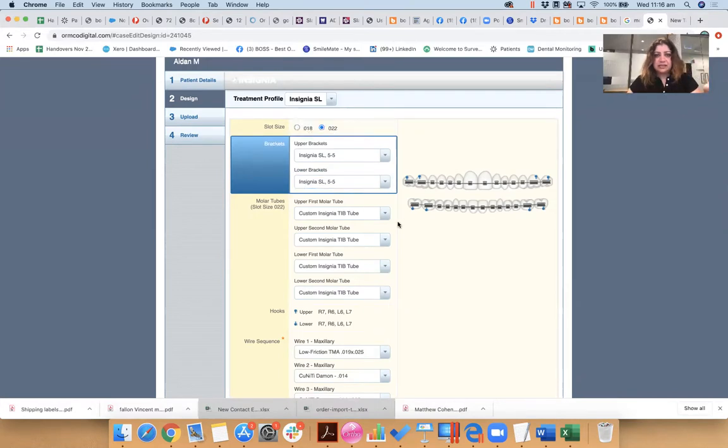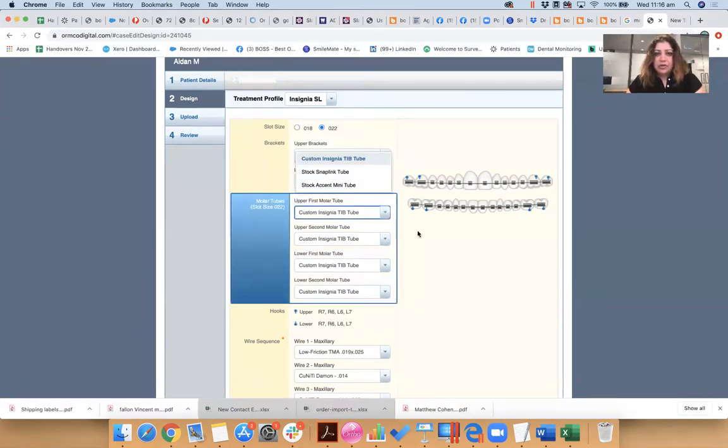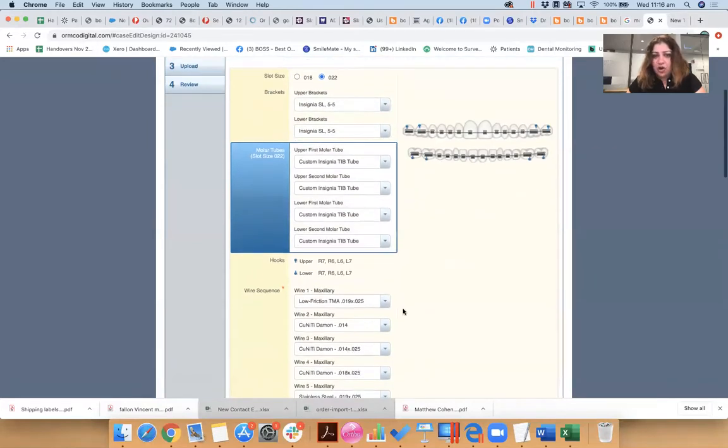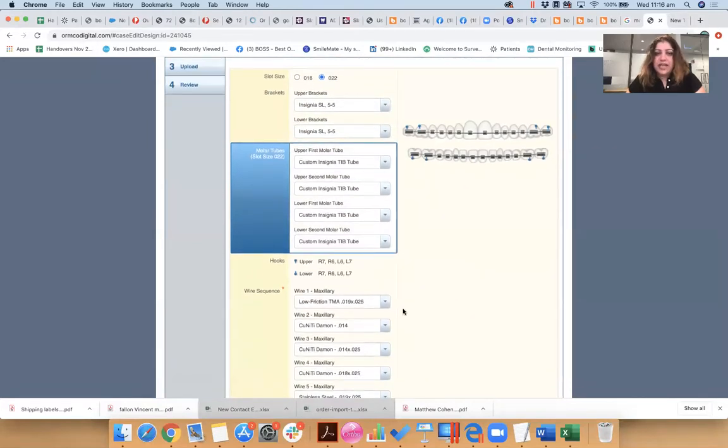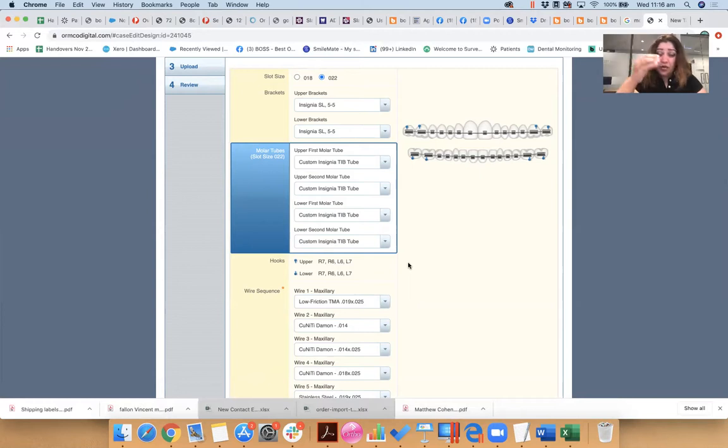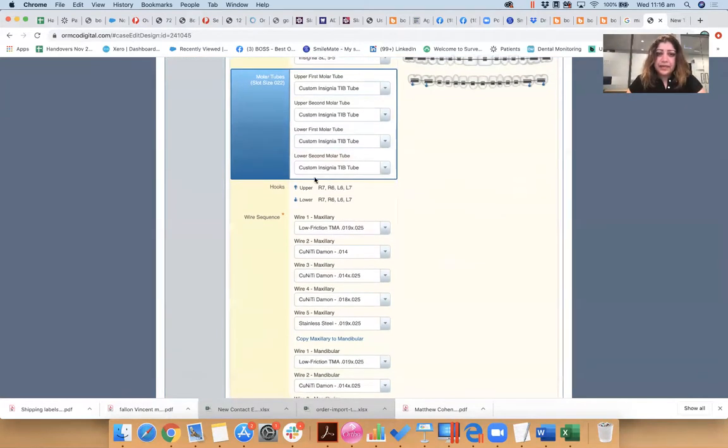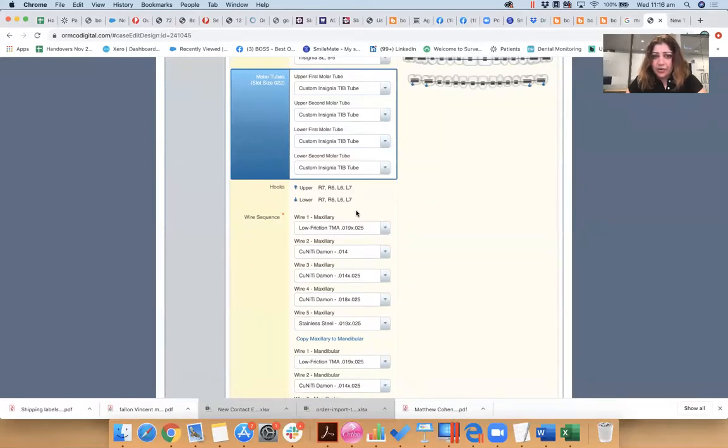The lower brackets as well, five to five, I want Insignia self-ligating. Now you can choose clear brackets or metal, but these are, when you choose Insignia, they understand that it's metal. Upper full of molar tubes, again I like everything custom. I don't like stock.